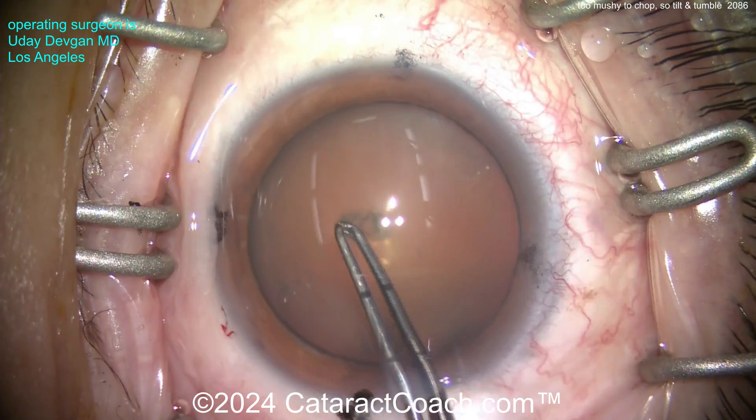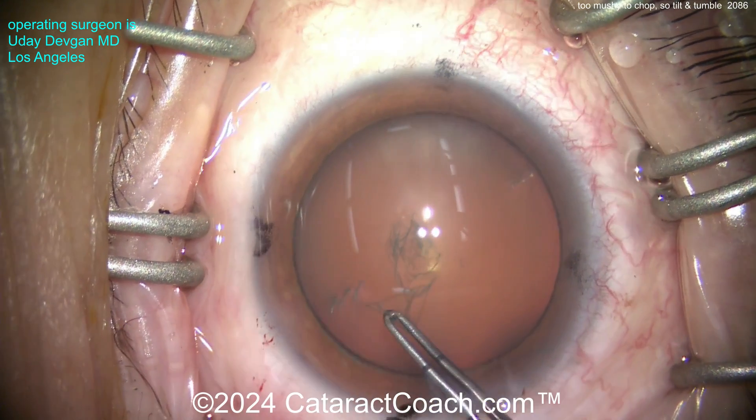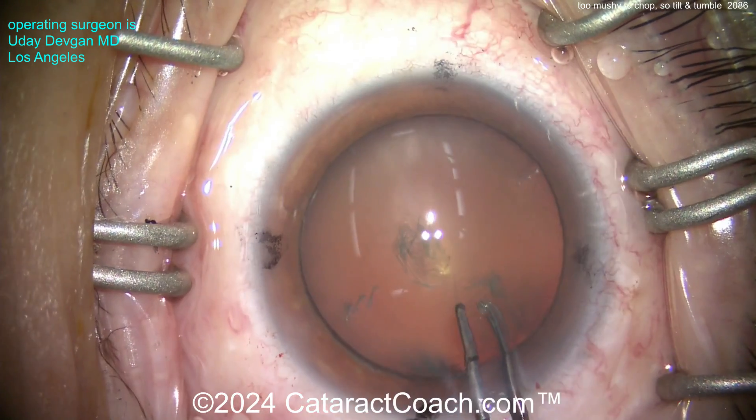You can see the ink marks at the limbus at the cardinal meridians, but even more importantly there are some little marks on the corneal epithelium showing the steep axis for our toric monofocal lens.